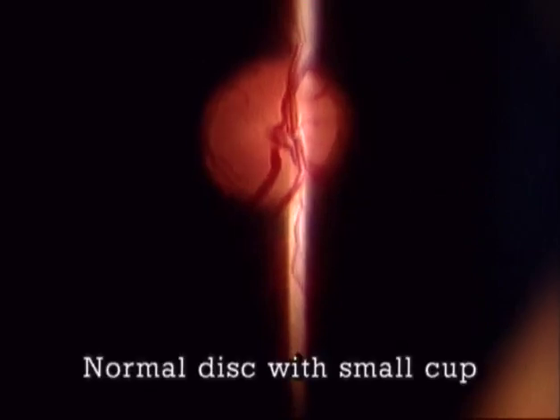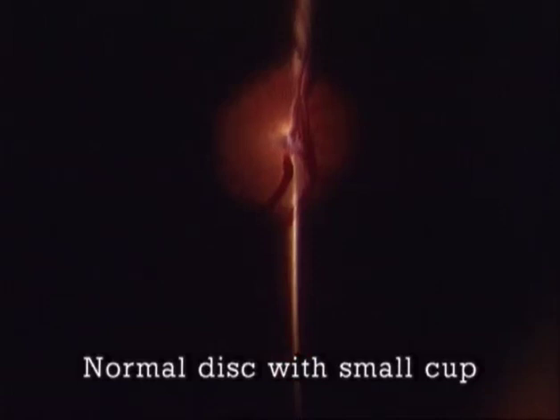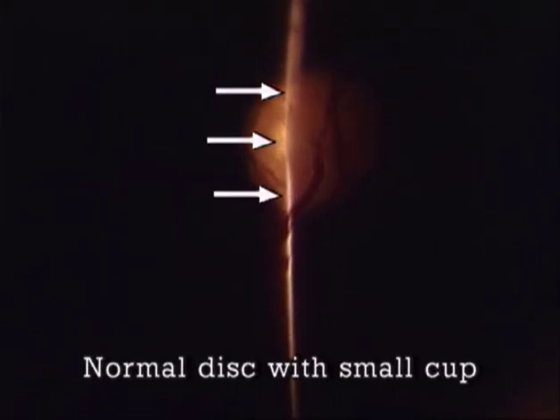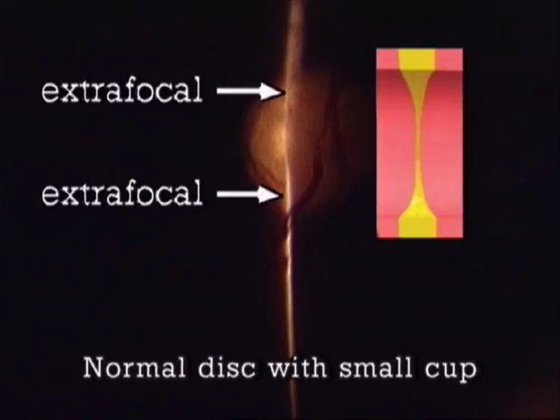This shows the example of an optic disc with a small central cup. In the temporal part of the disc, there is a difference in level between the rim and a shallow depression which is easily recognized by following the narrow light slit in its contour. Furthermore, the slit is thin at the bottom of the depression because there it is focused, and it becomes wider in the peripheral parts of the disc where it is slightly out of focus. When the light beam is shifted until it meets the cup, the slit becomes wider because the deep cup is behind the focus of the slit.